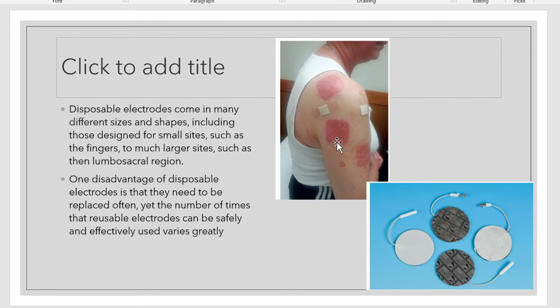So maybe kung padugayan pa, it could be resolved to blister. So although it is an allergy good siya, pero plus pa the electricity. So as we all know, when you are allergic, there's an inflammation sa skin, no? So ang iyahang permeability will become more permeable in tissue, so sulod ang current, so dali siya mapasok. So, nana na siya ang iyahang kwan.